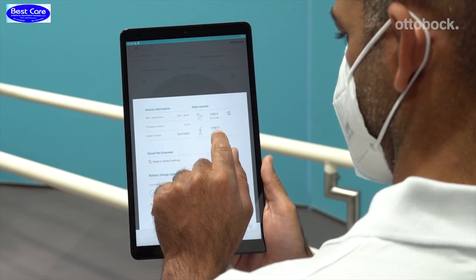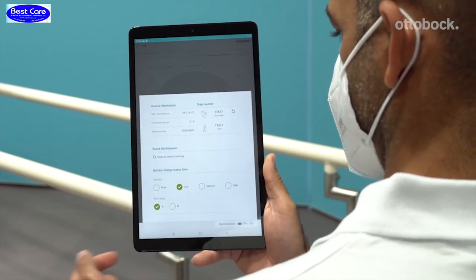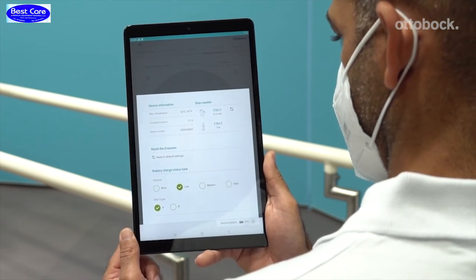In the upper right-hand corner, the step count is displayed. The total step count shows all steps ever taken with the Empower. The up-to-date step count shows the steps in a specific period of time. This can be reset via the reset symbol.